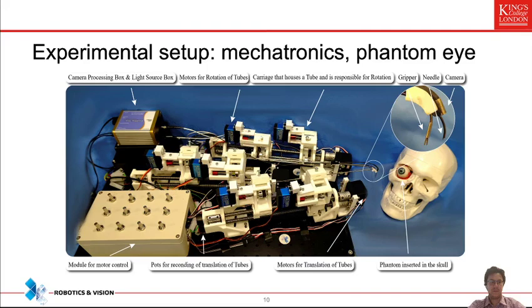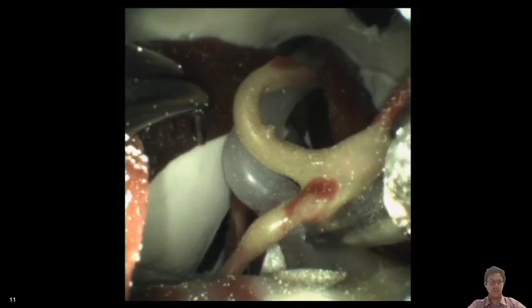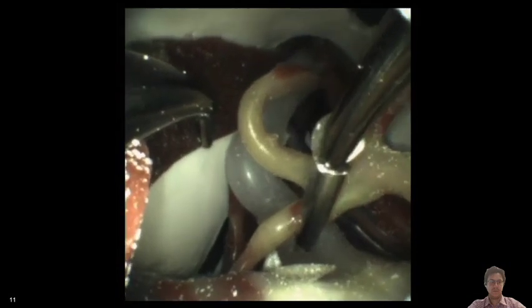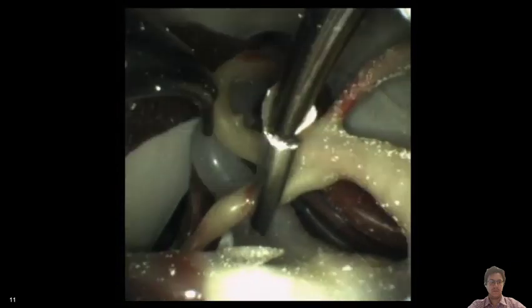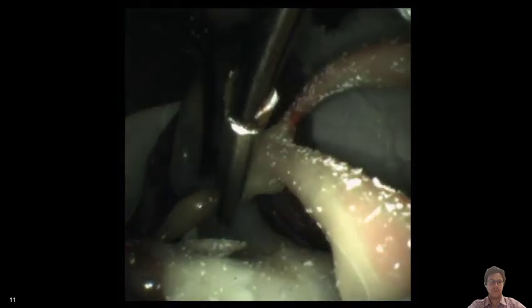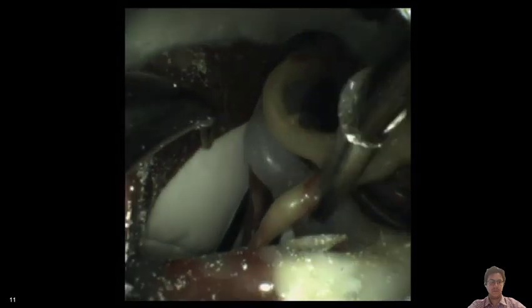We then created our robotic system based on these designs. This is a simple device where translation and rotation of the tubes is controlled through knobs. We deployed it within the phantom eye and visualized whether we could reach a location of interest, grasp the optic nerve, and confirm the camera has appropriate parameters. One arm is controlled to reach the optic nerve — the white translucent construct — and you can poke it to get a sense of how you would navigate in this small cavity.